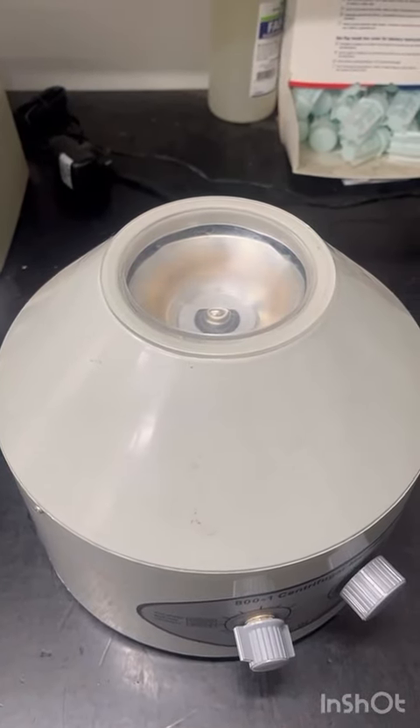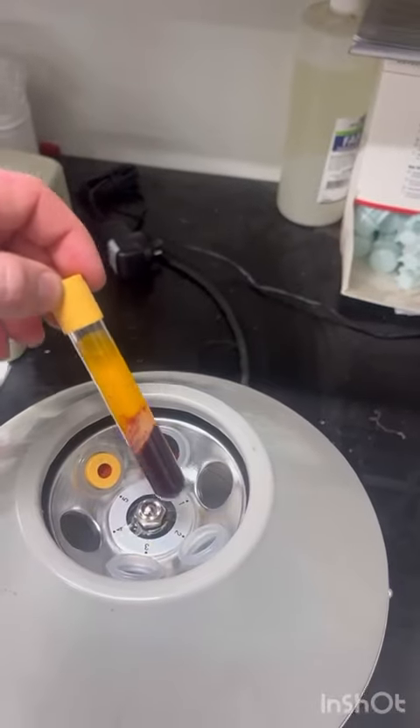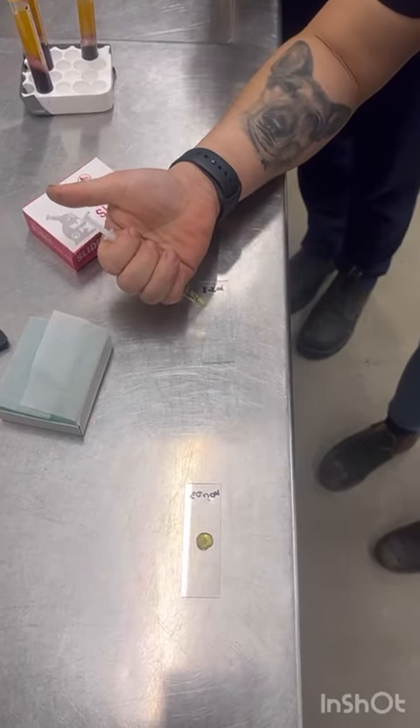So we collect blood from the donor and the patient. We spin the blood down to separate the cells from the serum. Now we need to cross-match to make sure the recipient blood does not have any antibodies that may react with our patient blood.